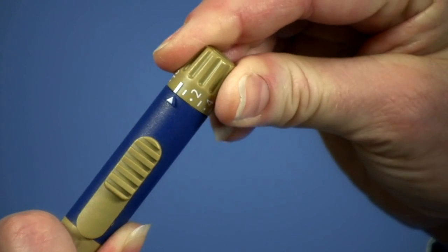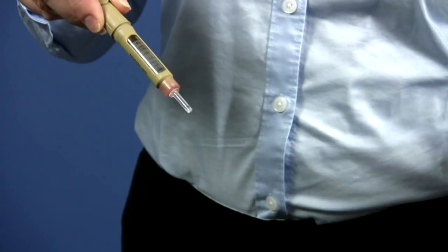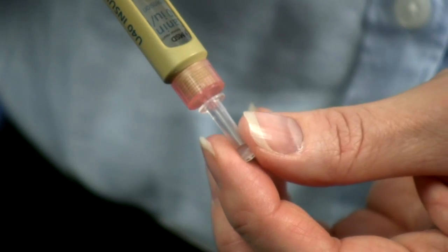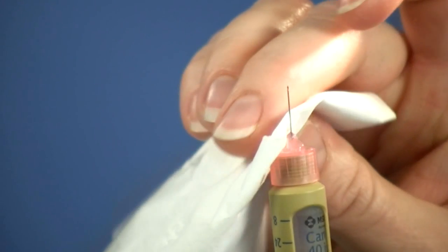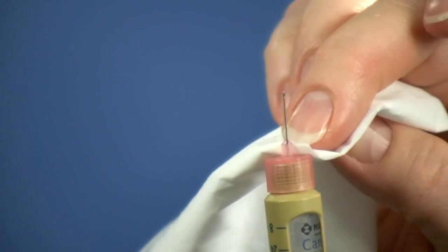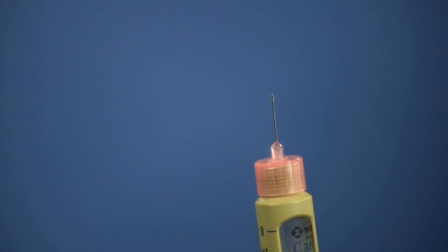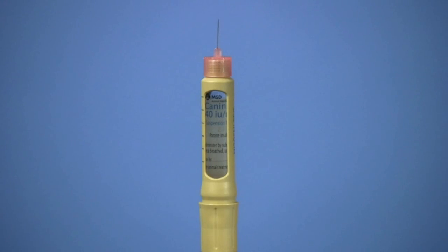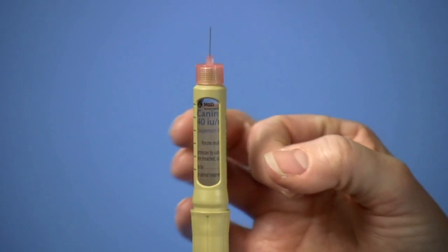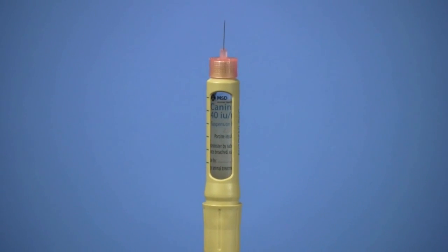Dial 1 unit on the dose selector. Then remove the VetPen cap and the inner protective needle cap. Keep a clean, dry piece of tissue or swab handy to absorb any insulin that comes out of the needle tip during the priming process. Hold the pen with the needle pointing upwards. Tap the cartridge gently with your finger a few times to push any air bubbles to the top.